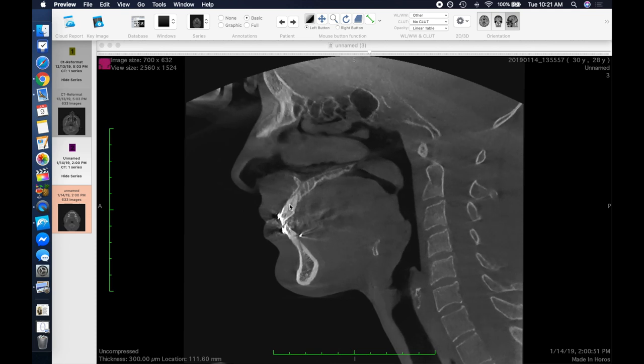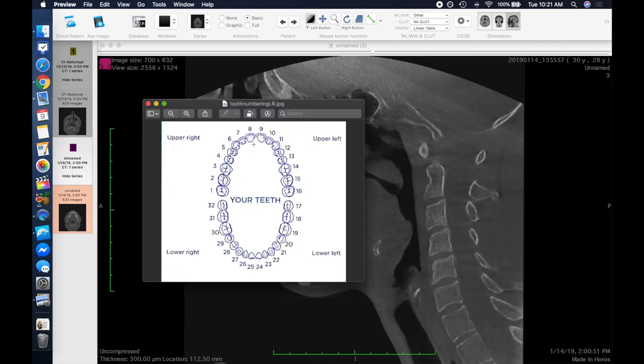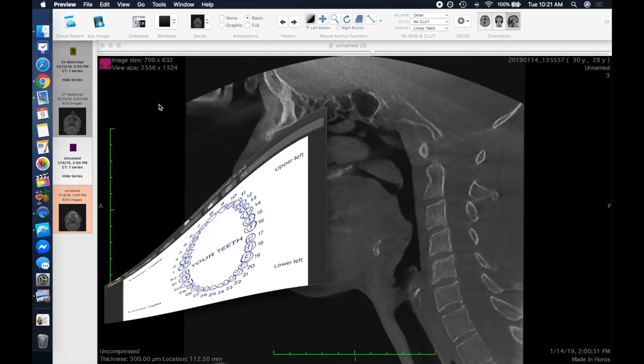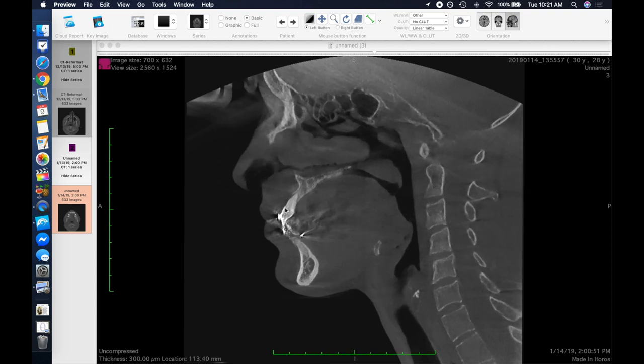Let's proceed to the next tooth. This is tooth number 8, the upper right front tooth. And again, where before AGGA we had alveolar bone coming all the way down the front of the root, here we have just a sliver of alveolar bone up at the tip of the root. Mostly, though, the tooth is completely out of bone. Either the bone has resorbed or the tooth has been pushed through the bone. Whatever it was, there's almost no bone left on the front side of the root of this tooth.